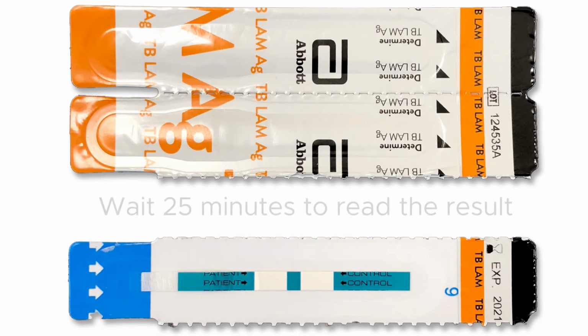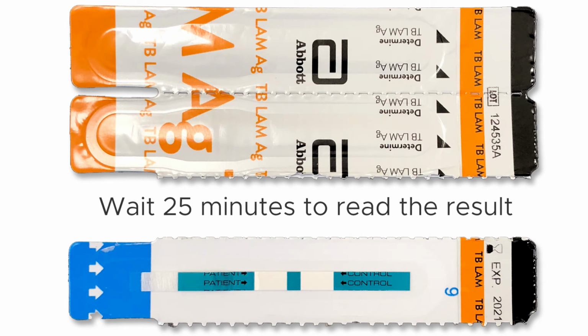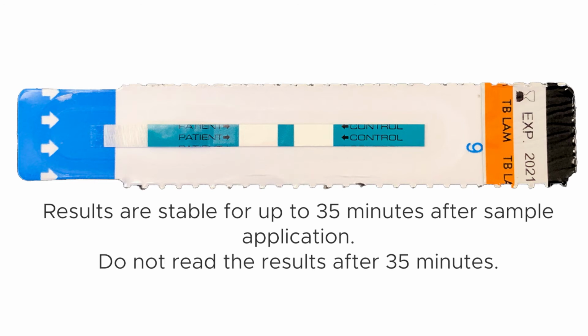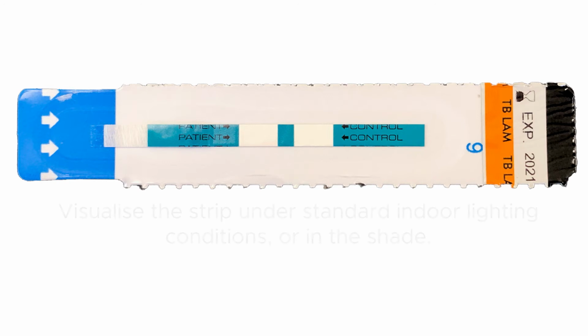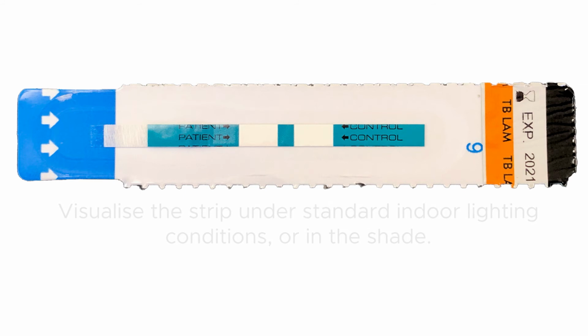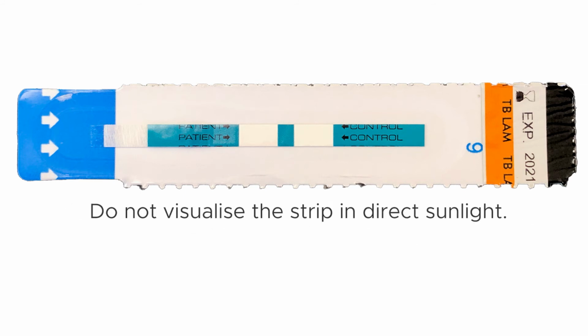Interpretation of results and quality control. After 25 minutes of incubation, your results are ready to be interpreted. Results are stable for up to 35 minutes after sample application. Do not read beyond 35 minutes to avoid reading incorrect results. To read the result, visualize the strip under standard indoor lighting conditions or in the shade. Do not visualize the strip under direct sunlight.